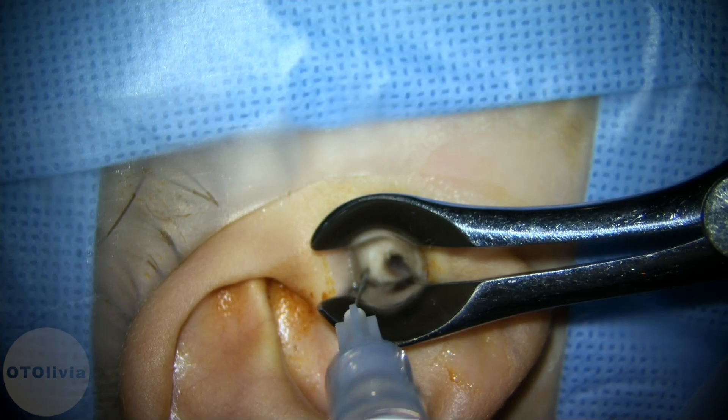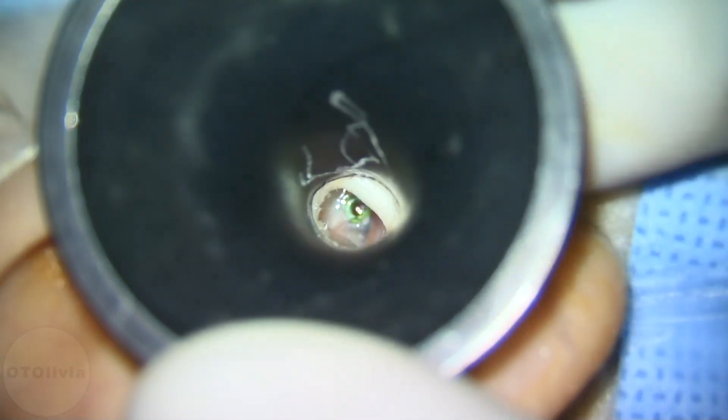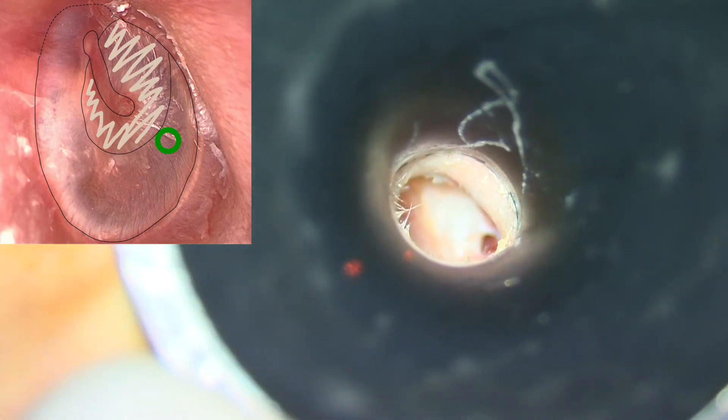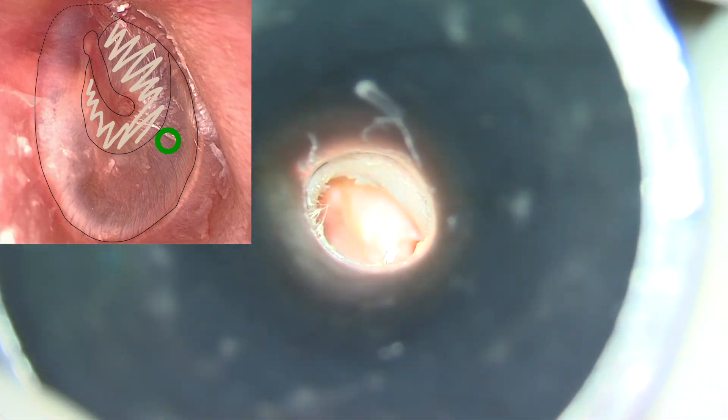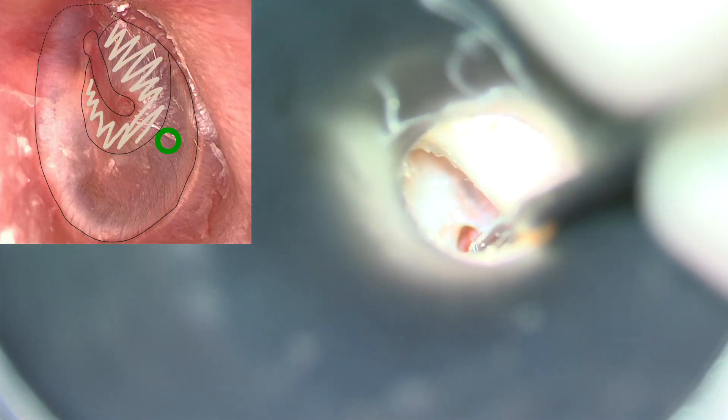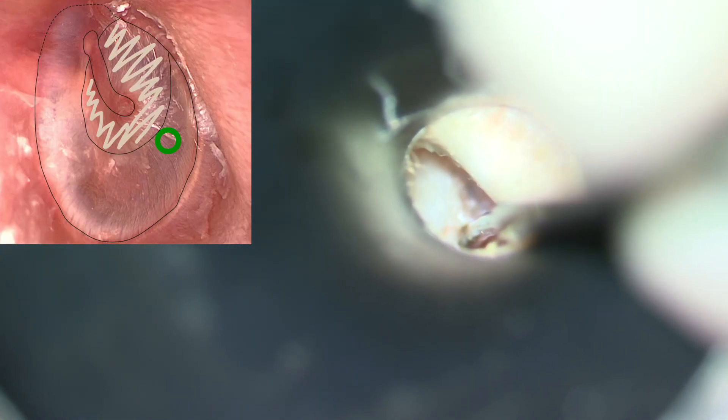We start by making a four-quadrant injection in the ear canal before removing the tube. Examining the ear, you can see the cholesteatoma cyst in the anterior superior quadrant. In this view you cannot see the manubrium; we're looking anterior to the malleus at this point.